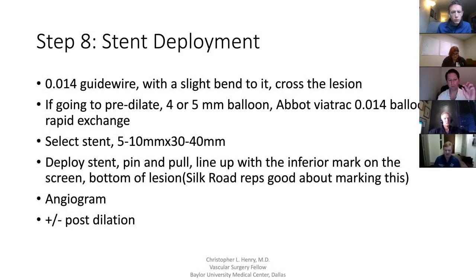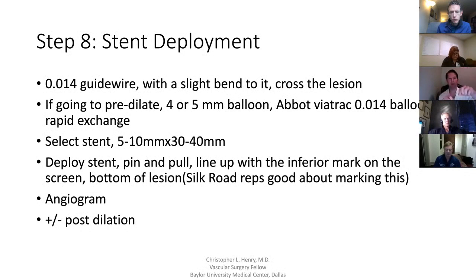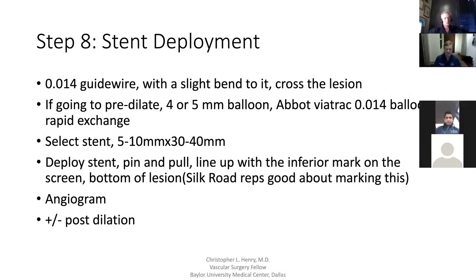For stent deployment, we put a small bend on the 0.014 guidewire to give a little maneuverability once in there. Then crawl across the lesion under flow reversal and pre-dilate with a 4 or 5 mm balloon depending on preference. Use the VITRAC rapid exchange system. Select the stent, then have the rep mark the inferior aspect of the landing zone on screen — that's what I'm looking at as I deploy the stent. I want the bottom of the stent right at that mark; don't look at the top, just focus on the bottom. Then do an angiogram and plus/minus post-dilation.